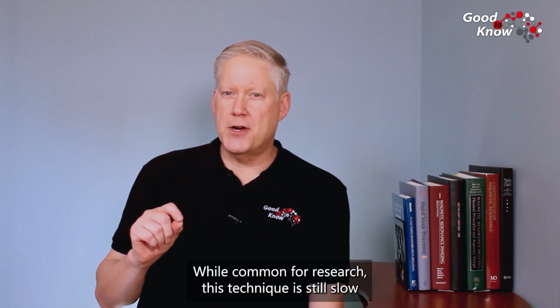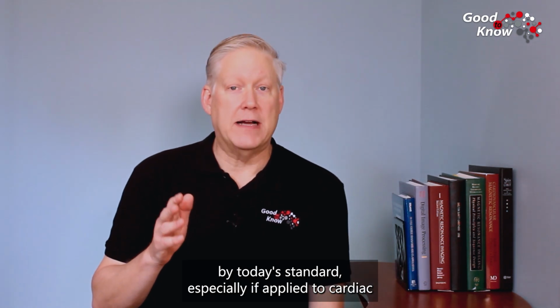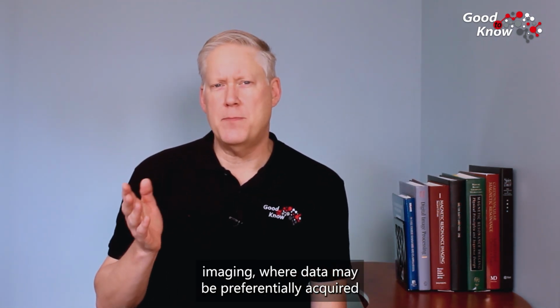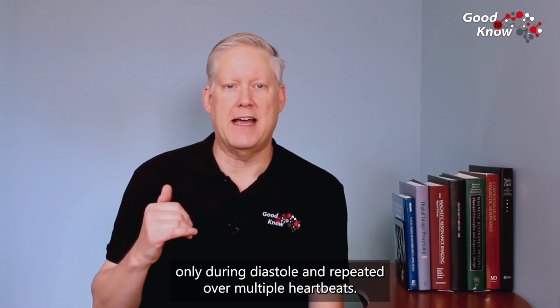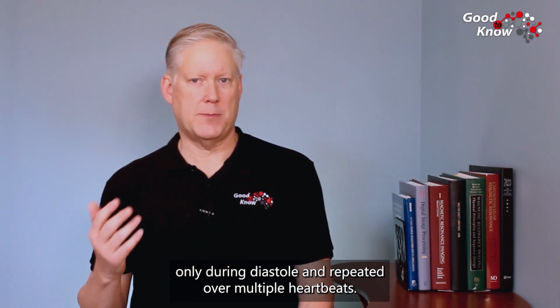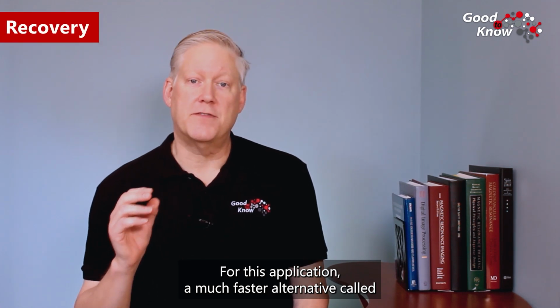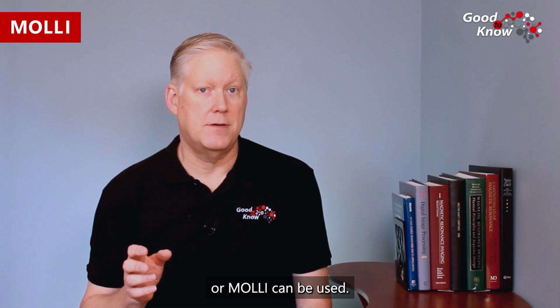While common for research, this technique is still slow by today's standards, especially if applied to cardiac imaging, where data may be preferentially acquired only during diastole and repeated over multiple heartbeats. For this application, a much faster alternative called Modified Look Locker Inversion Recovery, or MOLLI, can be used.